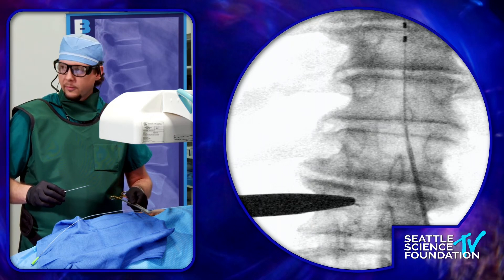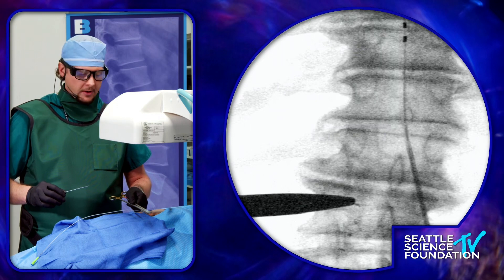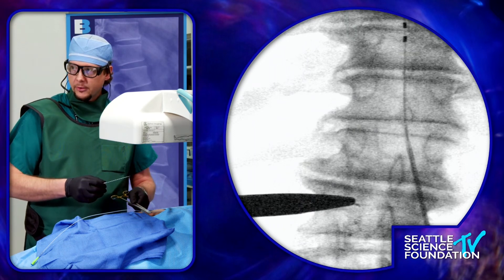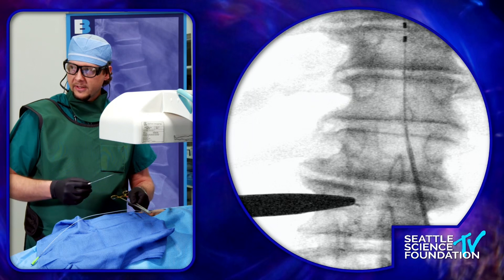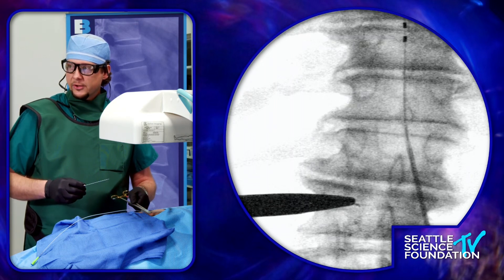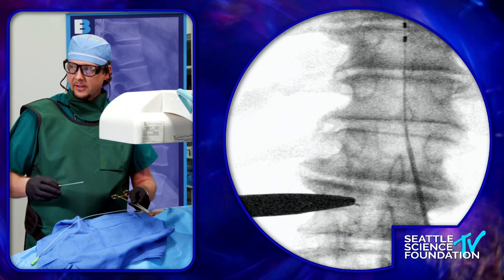Get a comfort level of what's going to work best for you — everybody's different. Entry level can vary; we went in at T11-12 here, but a lot of times people will prefer to go lower. I tend to like T12-L1 because of access, and there may be surgical hardware inferiorly. Thinking back to physical examination: how lordotic is the lumbar curve? Body habitus plays a big role in trajectory.